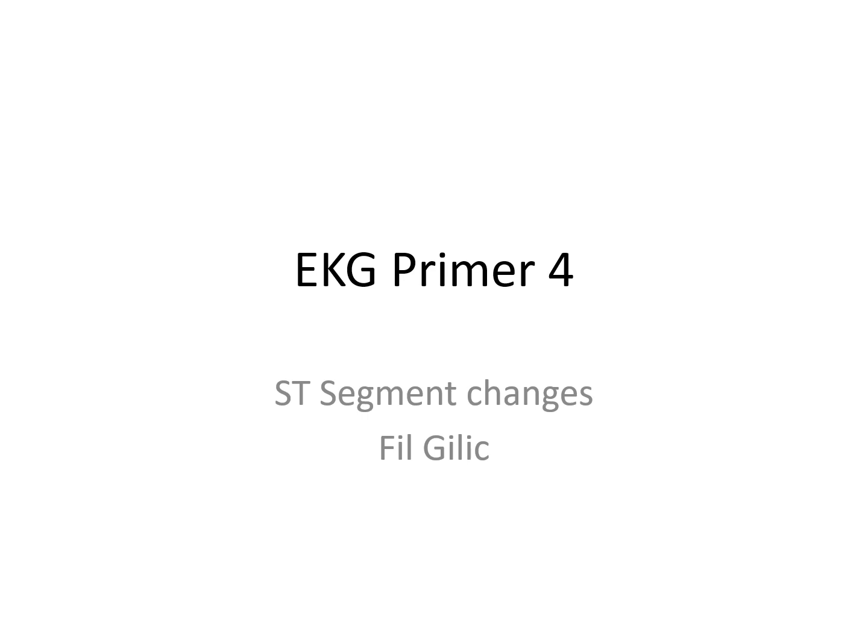Welcome back. This is ECG Primer 4. In this session, we will be dealing with the ST segment changes.